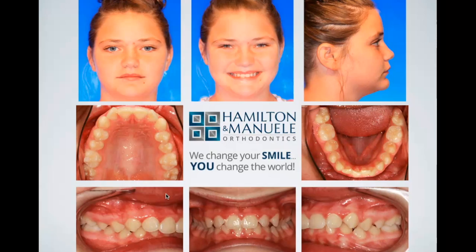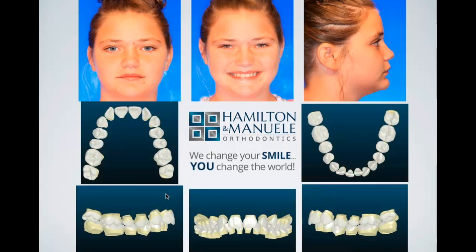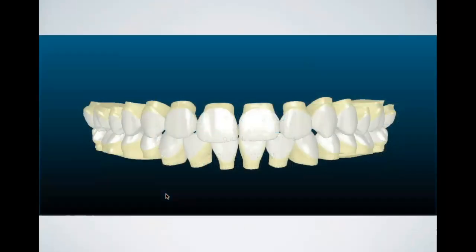But the concept behind digital orthodontics is that you take a scan of the teeth and you set up your final occlusion. So he had mentioned that with his Brius case, the patient wasn't very motivated. So he's like, hey, let me show you what your teeth are going to look like, even though they don't look like that now, and hopefully give them some motivation to carry on. The way that's done is you transfer their teeth into a digital intraoral scan. And once you have a digital intraoral scan, you can move the teeth digitally, right? So the way most of these systems work is that you straighten the teeth digitally. You put them where you want them to go.